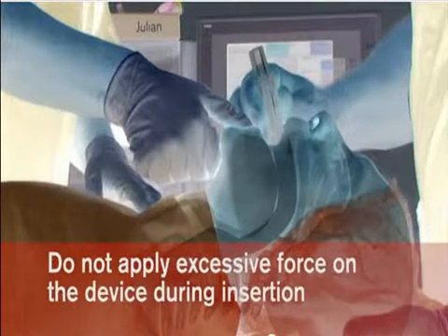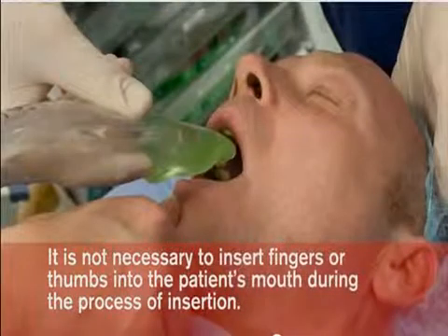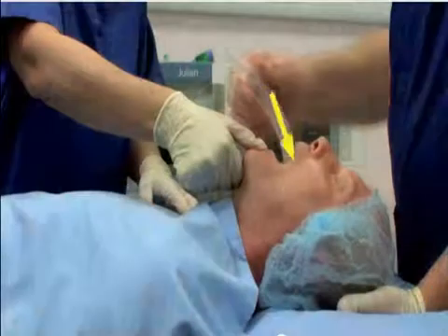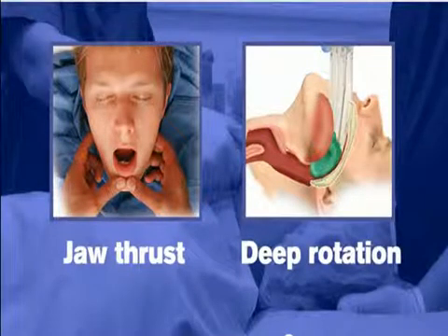Introduce the leading soft tip into the mouth of the patient in a direction towards the hard palate. Glide the device downwards and backwards along the hard palate with a continuous but gentle push until a definitive resistance is felt. Do not apply excessive force on the device during insertion. It is not necessary to insert fingers or thumbs into the patient's mouth during the process of insertion. If there is early resistance during insertion, a jaw thrust or insertion with deep rotation is recommended.